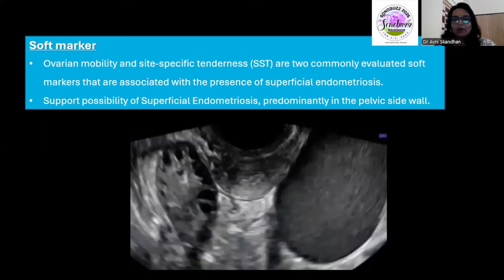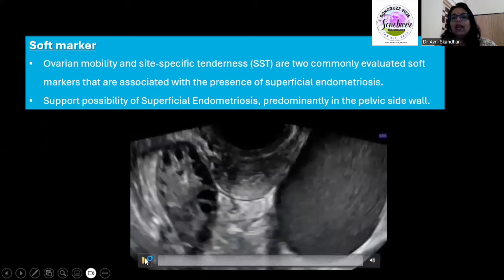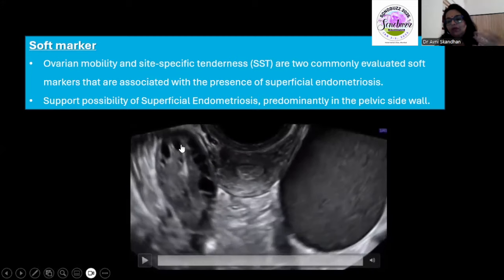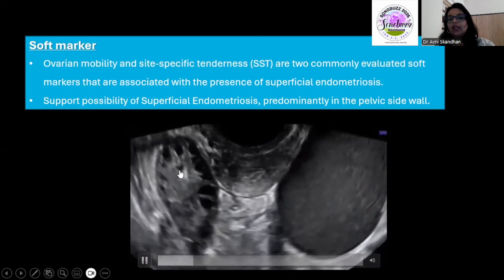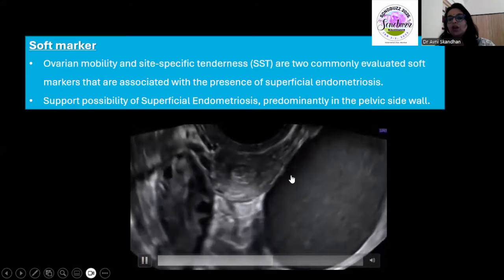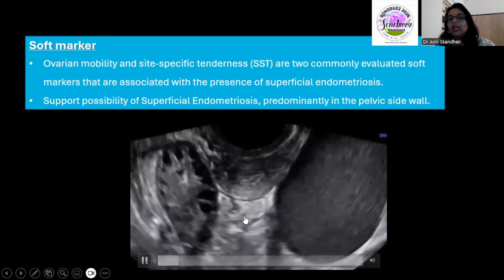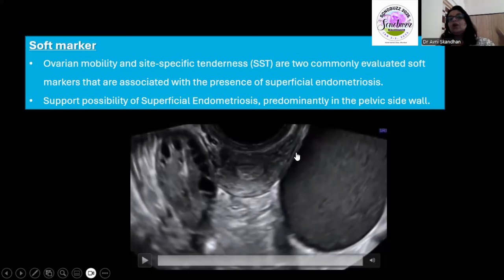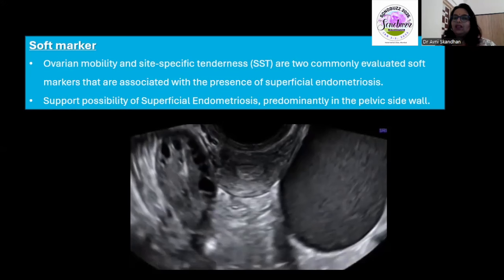One of the important soft markers is ovarian mobility. Here you can see a PCO morphology ovary which is actually moving against the uterus when you move it — it moves against the uterus independently. But in another case, the ovary is moving under pressure but moving in unison with the uterus — not against it — because it is adherent. Even if you had not seen the deposits, an ovary sitting there and moving in unison with the uterus tells you there is possibly a superficial endometriotic deposit with adhesion, even if you cannot demonstrate a deep deposit.